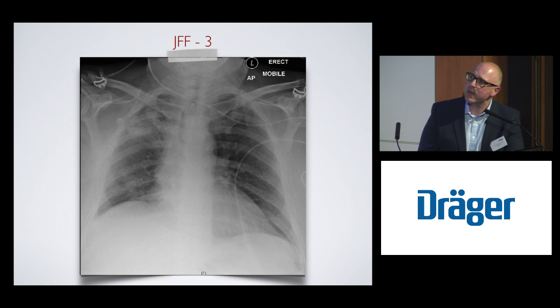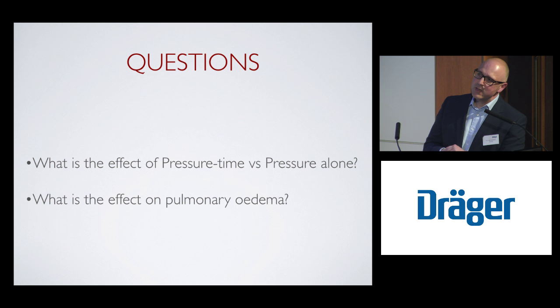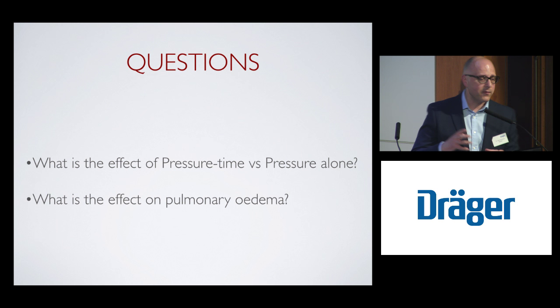So now this is, as a junior doctor, my limit, the comfort of my knowledge. So I'm going to ask. The question is, we've looked at the fact that some of these patients, after 40 seconds, between 5 and 45 centimeters of water, show very little recruitment. But then after 3 days on APRV, there is massive lung recruitment.